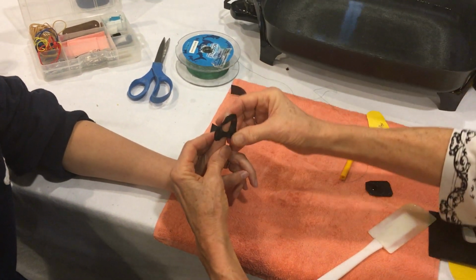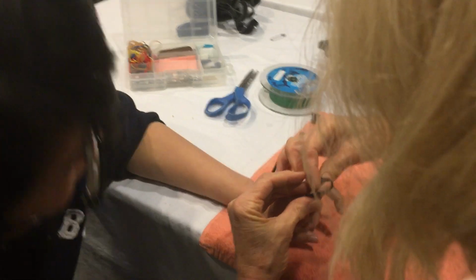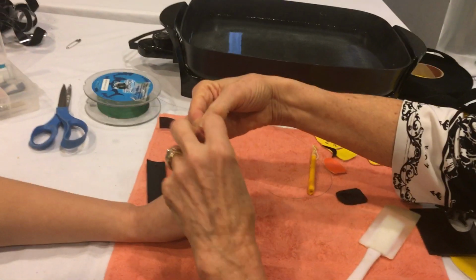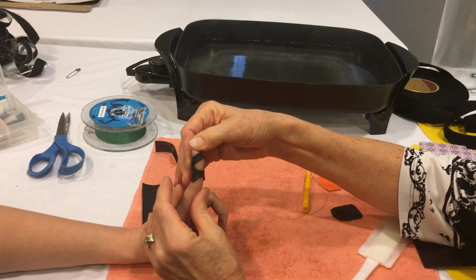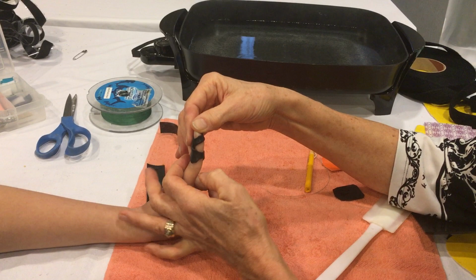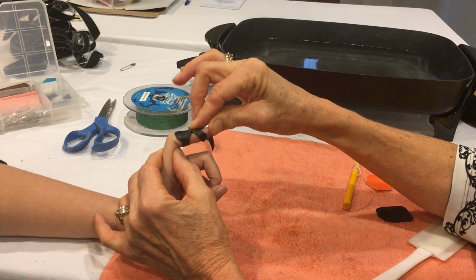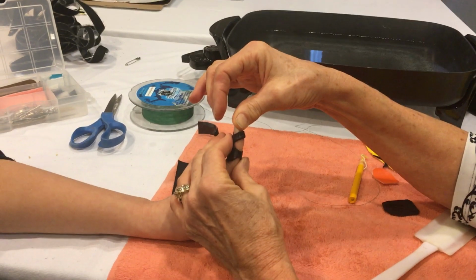Then we're going to make sure that we're in the middle of the middle phalanx down here, the middle of the distal phalanx. And then these edges on the side are going to come up and wrap over the dorsal aspect of the DIP joint. And that's going to support the DIP joint in slight hyperextension. On the volar surface, we are far enough away from the PIP joint so that joint is going to be able to flex all the way down, and this is going to hold the distal phalanx in slight hyperextension.